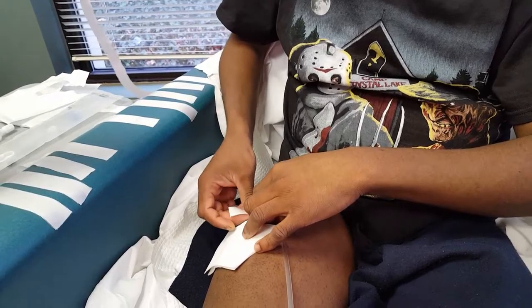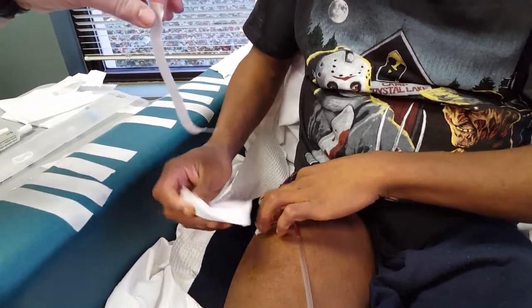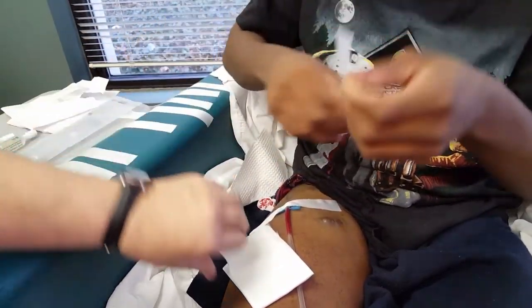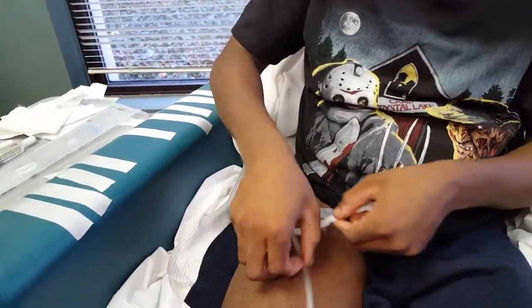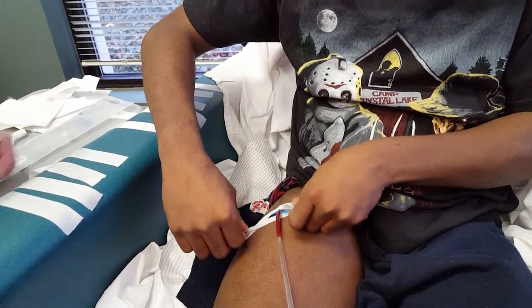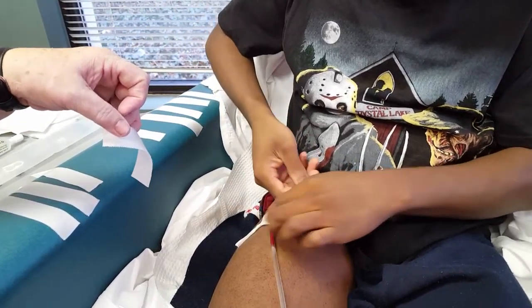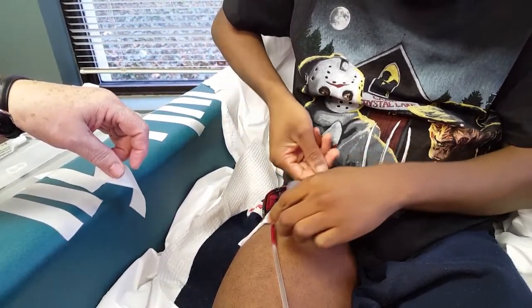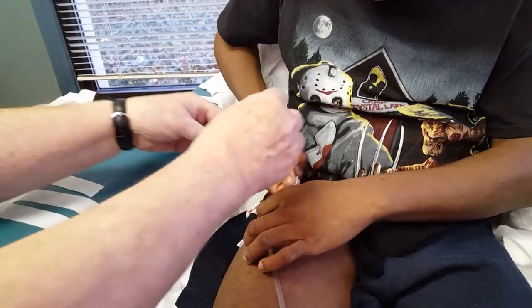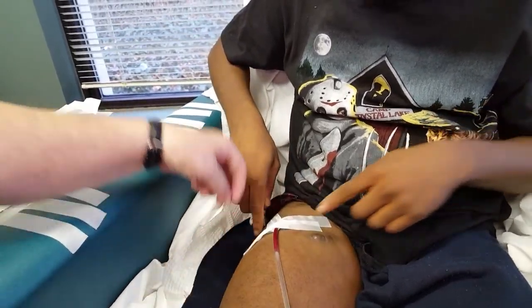Because like yesterday. Yeah, we're not going to have another day like yesterday. Here's the other tape. This one goes right there, so this one really holds it in. And that one goes over the top.